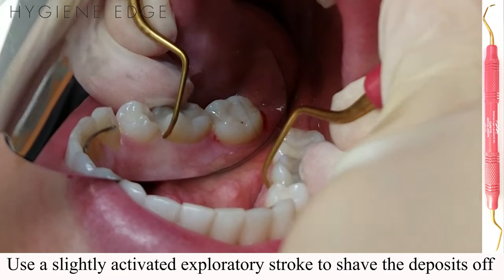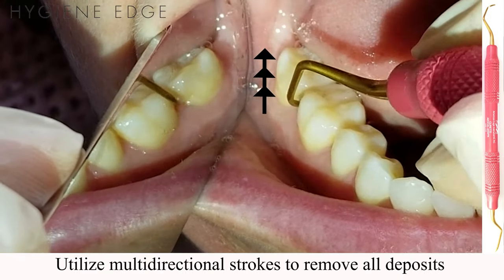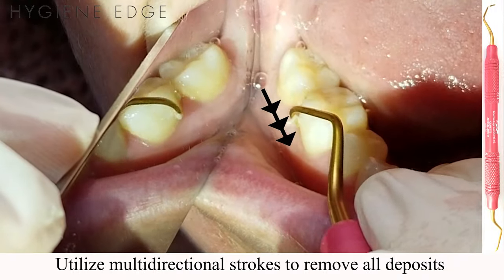Remember not to fracture or pop off calculus when using XP Sharpen Free instruments. Scale the teeth with vertical strokes on the mesial and distal, oblique strokes on the buccal and lingual, and horizontal strokes on the line angles.